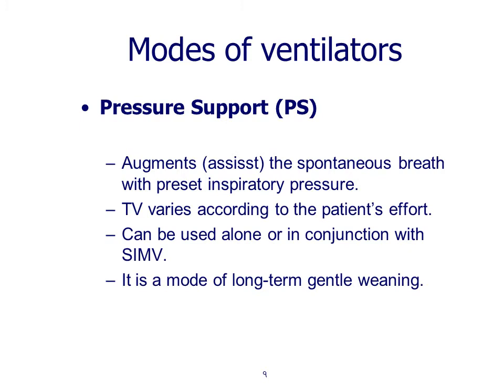The pressure support which augments or assists يساعد the spontaneous breath with the preset inspiratory pressure بحيث انه احنا بنعطي pressure support يدعم دخول الهواء الى المريض. Tidal volume varies according to the patient effort, can be used alone or in conjunction with SIMV. It's used as a mode for long-term gentle weaning.